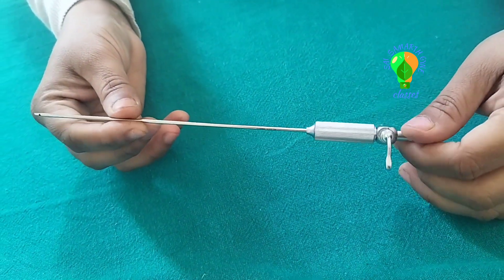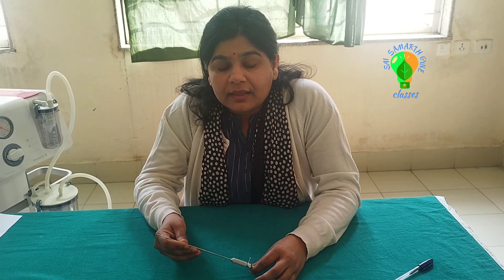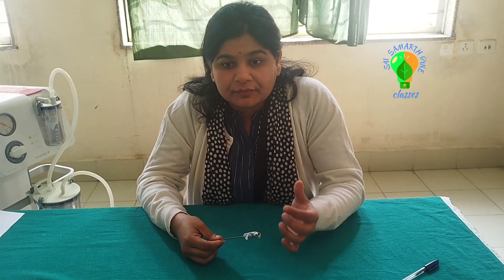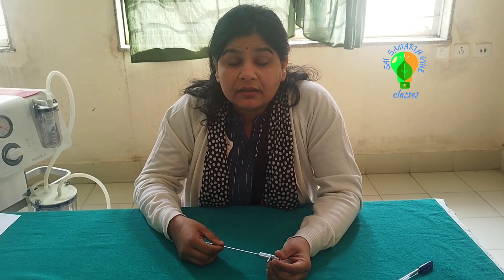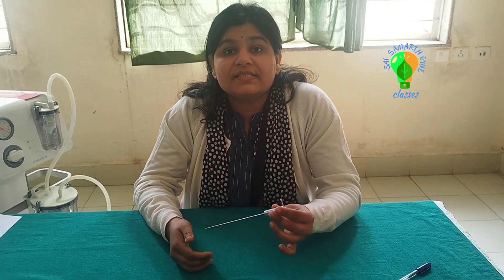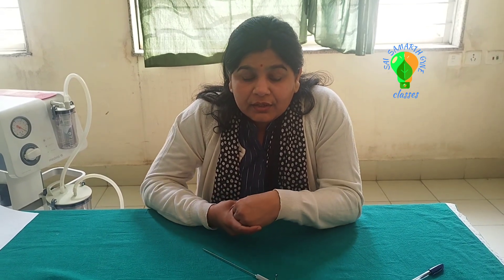This instrument is known as Veress Needle. It is used for laparoscopic access technique — when we put the laparoscope inside the abdomen and want to reach the peritoneal cavity. First we go through this Veress Needle, insert it, and fill some air inside the peritoneal cavity to create a pneumoperitoneum. After we enter the peritoneal cavity, visceral injuries will decrease.